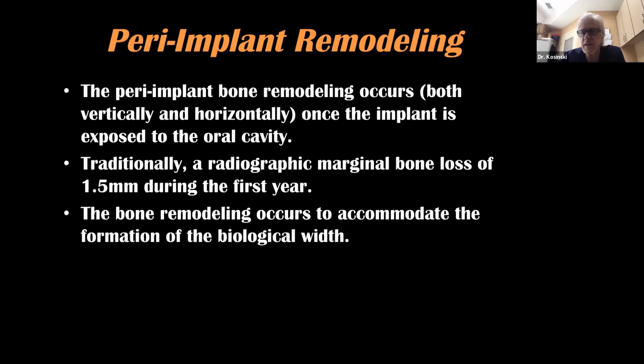We've all seen implants where we have bone shrinkage. Years ago, we would say we expected bone to shrink physiologically to the first 3 threads. That is not unusual or unnatural. With today's engineering, that doesn't happen quite as often as it once did, and there are certain reasons that we're going to discuss in a few minutes.